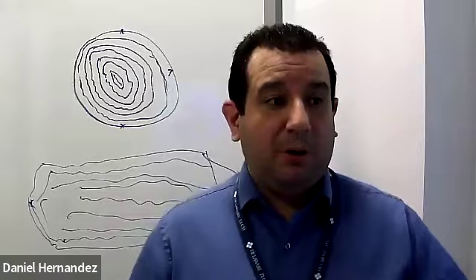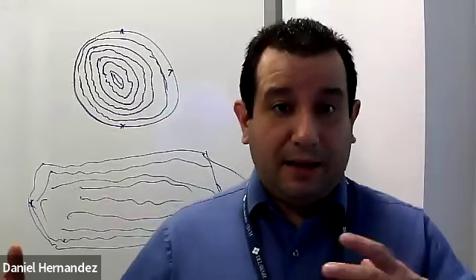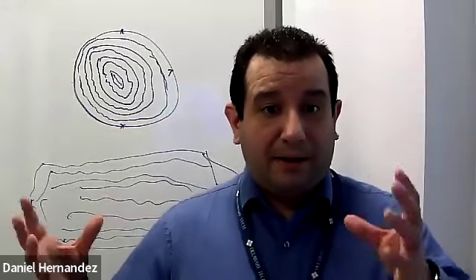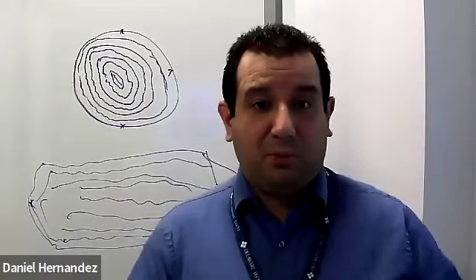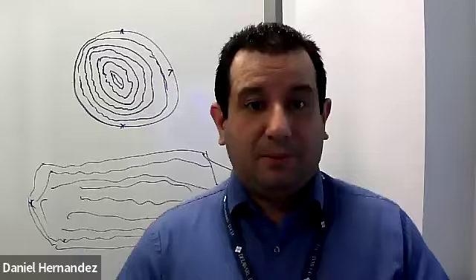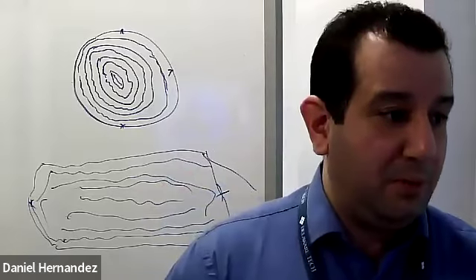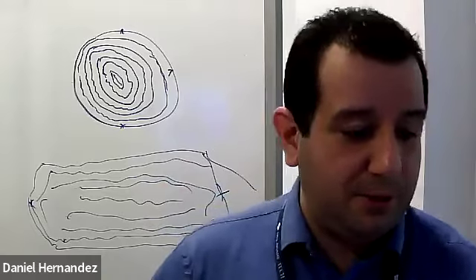So basically what we want to do is try and fill that stomach with some sort of contents to then image those contents passing through the pyloric channel into the duodenum. So there are very specific image or cine clips that we want to obtain to rule out hypertrophic pyloric stenosis, in addition to measurements.